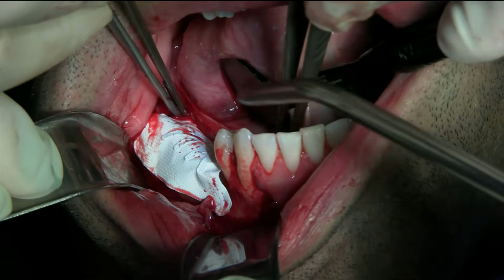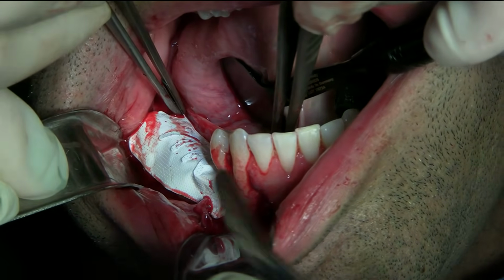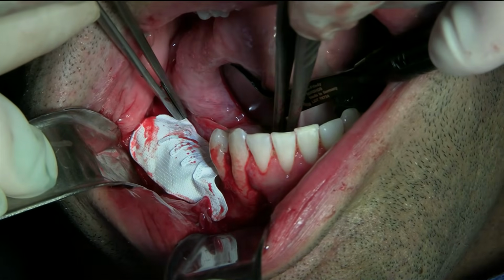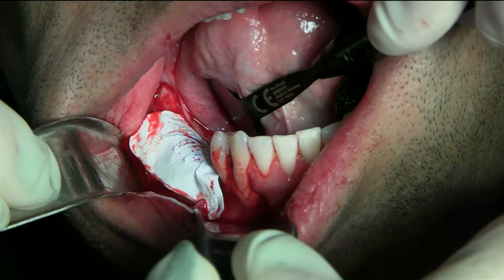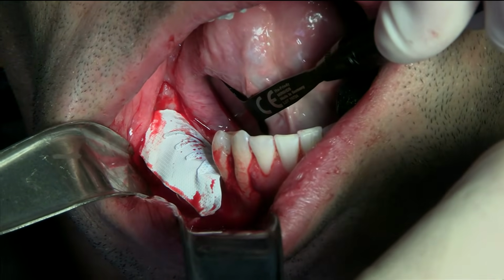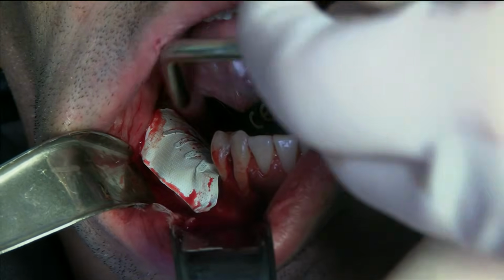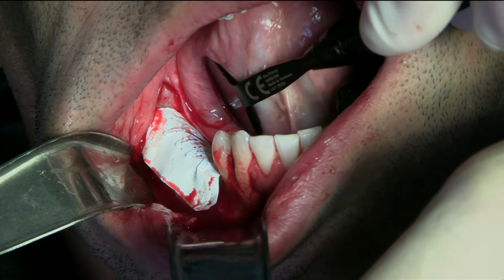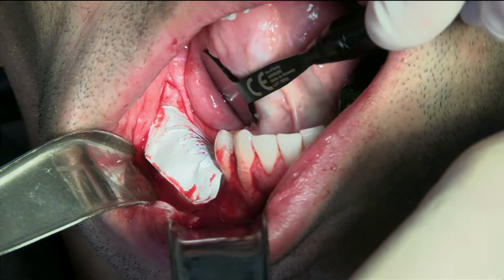So I can get a screw here. Probably here. Right here. And then so we leave this in. You keep retracting. Give me probably a tack. Yeah, give me a tack. Let's see. Okay, membrane is in position. So now this is the easy part. The hard part will be now to get a screw in here.